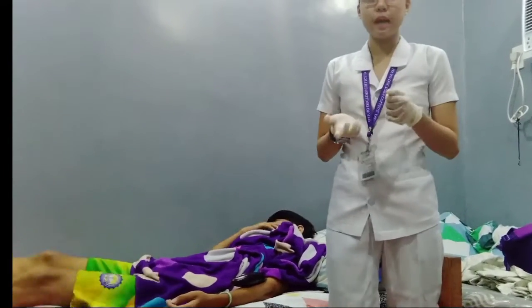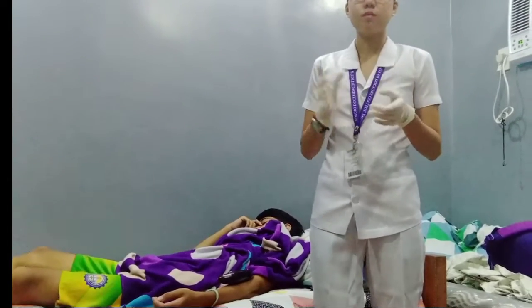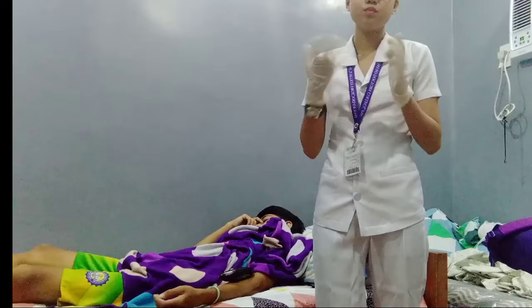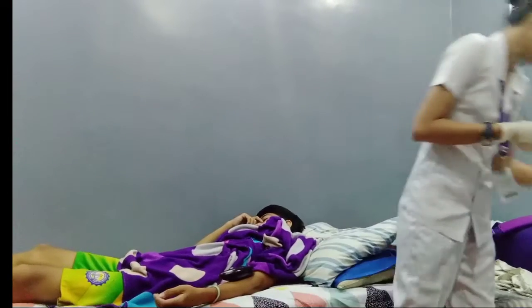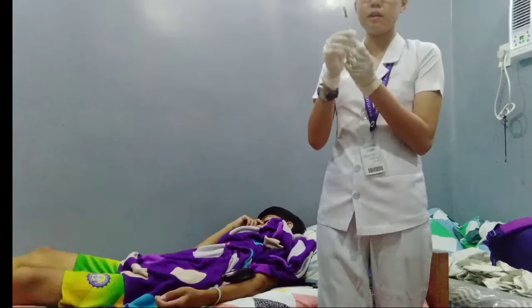Next, we need to remove the cap and hold the syringe between the thumb and forefinger of your dominant hand with the bevel of the needle pointing up, since your dominant hand is what you're most used to and provides more force and support. So my dominant hand is my right hand. I'll be using this. First, I need to remove the cap and point it up.